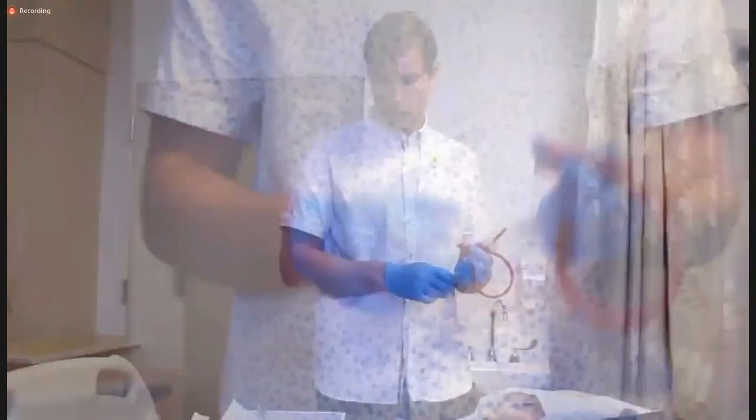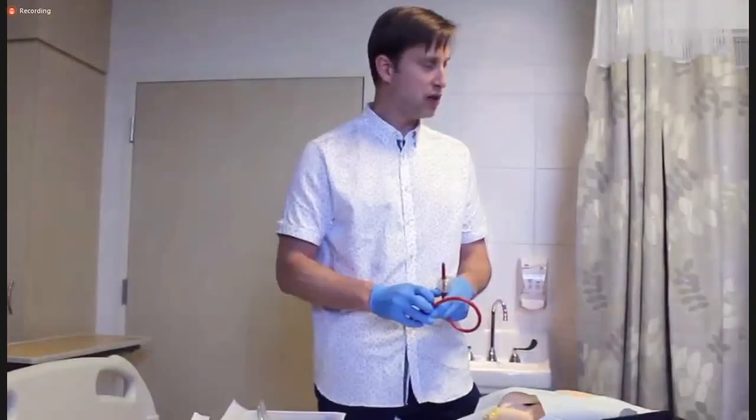Another issue that we'll encounter is people will have difficulties placing a catheter after a fairly long distance. So the catheter will go.